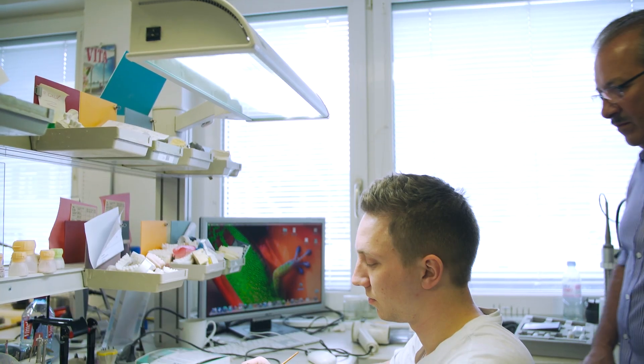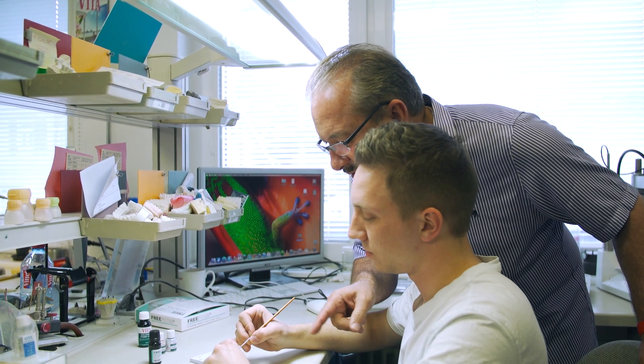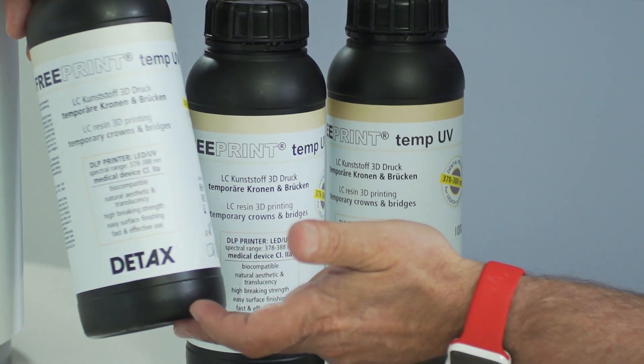Finally, we have a material to manufacture temporaries in the 3D printing method. Detax is one of the few companies worldwide which has produced a material which is extremely accurate. It's very abrasion resistant and comes in three different shades: shade A1, A2, and A3.